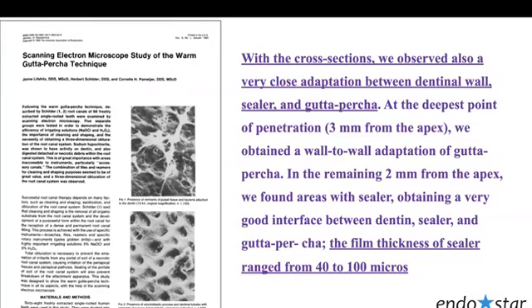Now, for the obturation, to finish this presentation, I personally like to do a vertical compaction. This is a technique that I like, and I'm showing here a very old article, but I think it's a great article. I know that there are many other techniques, and these techniques are very good. They are excellent. Many studies showed that the bioceramic obturation is very promising. I have my friend Dr. Rulal Hashim, who did a very nice study about bioceramic showing it's very promising.